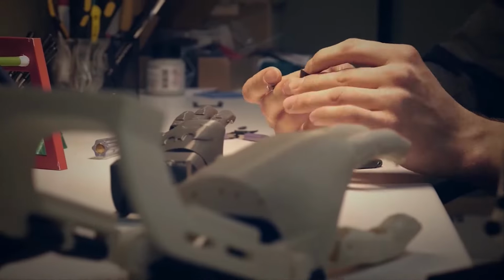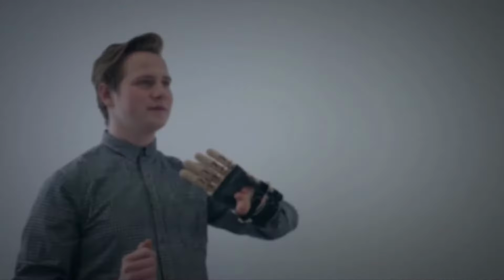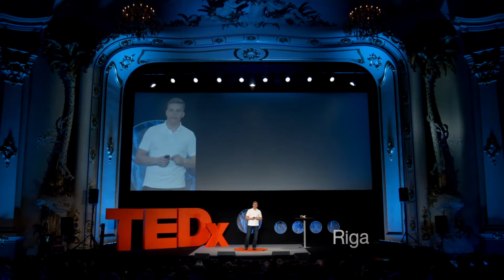And also, we did not need Janis over as many times because we had a 3D model of his hand. All the process was done in 1 day, which is a huge improvement over the 2 weeks that it took us to help Richards. But still, it doesn't come even close to helping everyone in need.